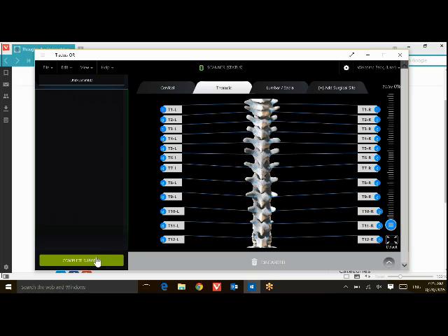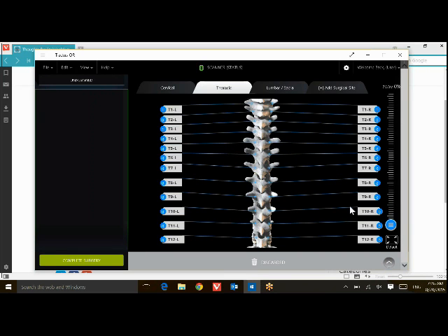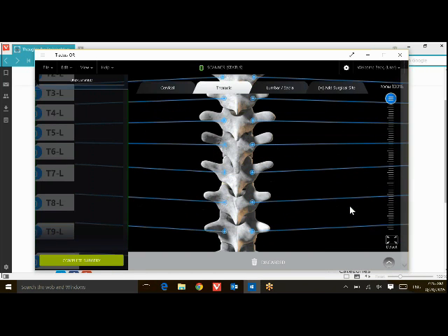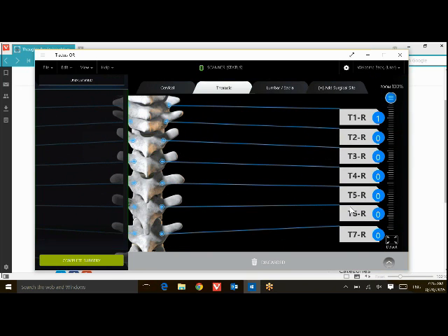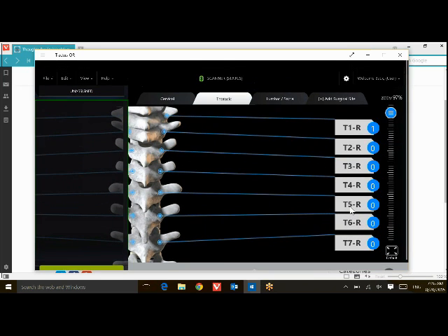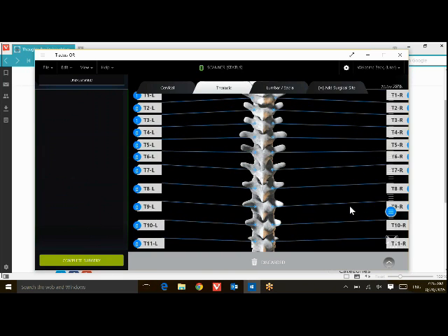Now we'll go ahead and hit complete surgery. Oh, before I do that, I would also like to mention, I'm going to use my fingers for this. We can pinch and zoom if we want to focus on specific areas and regions, and we have either a side trigger here to manage the zoom, or we can do pinch and zoom, kind of like your cell phone.